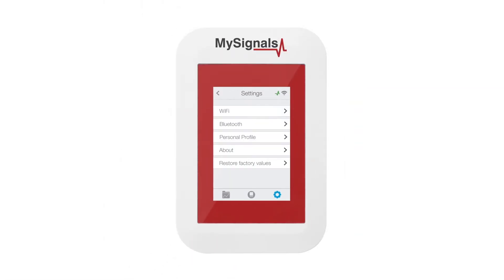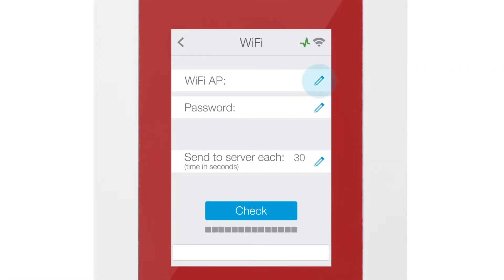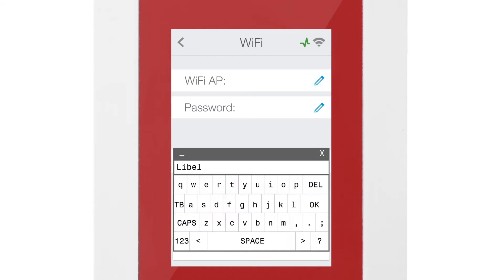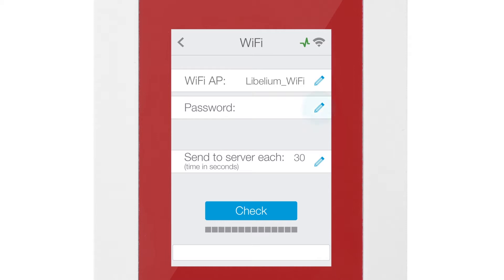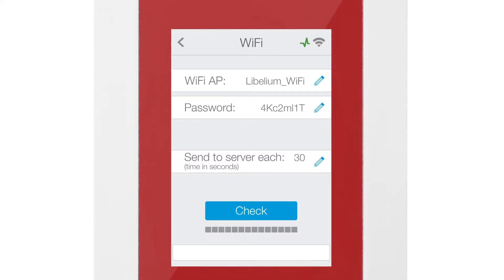Inside the Settings menu, click on Wi-Fi and then write the name and password of the Wi-Fi network you want to connect to. After that, click the Check button and wait until the Wi-Fi connection is validated.